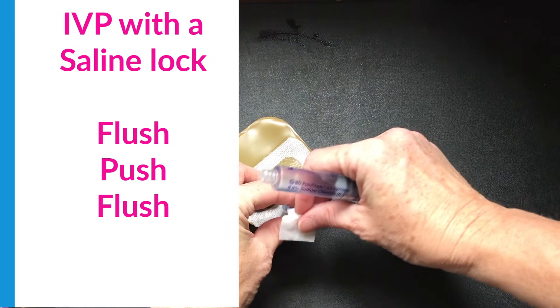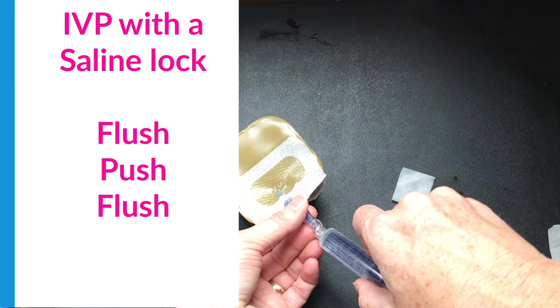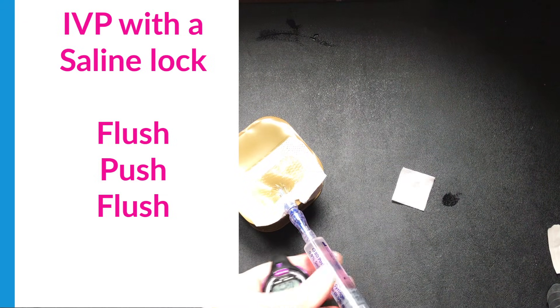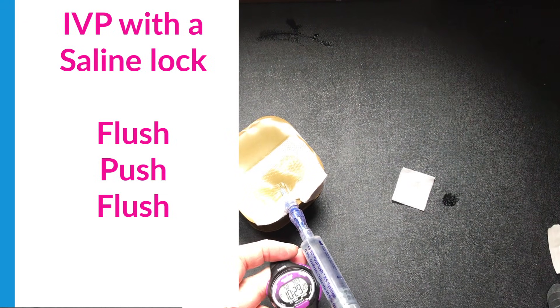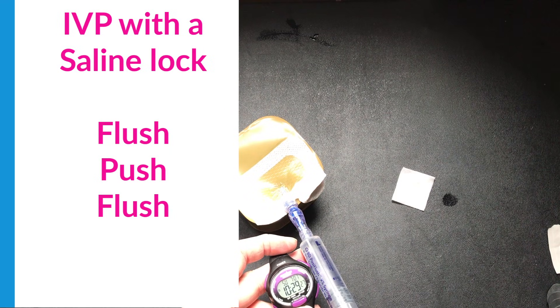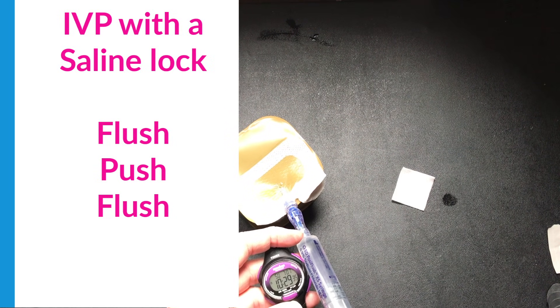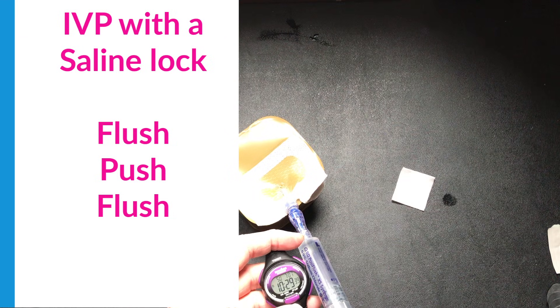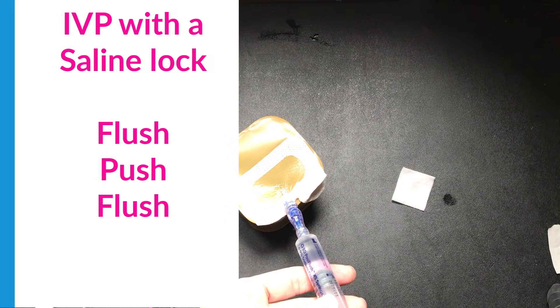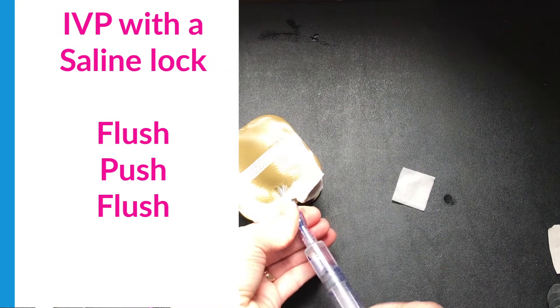Once the medication is administered, we need to clean the hub again — every time we access we need to clean the hub. Because the line is still full of medication, I need to instill 3 cc's of flush at the same rate. So I push just a little bit and pause, push and pause, continuing until I feel I've got the medication through. Then I can finish off the last couple cc's of saline flush normally, and disconnect. You're done.